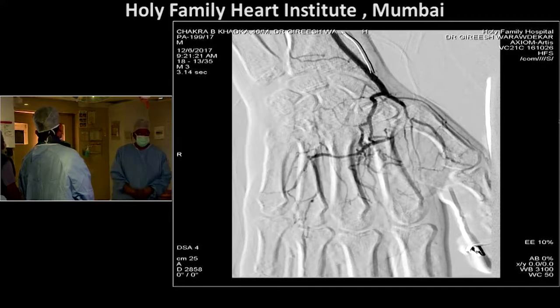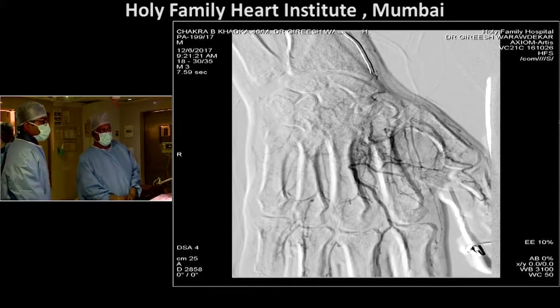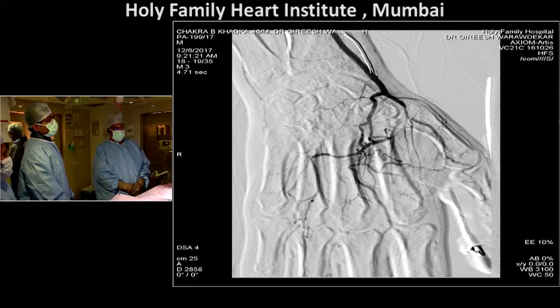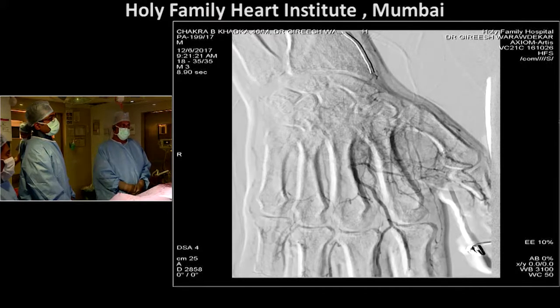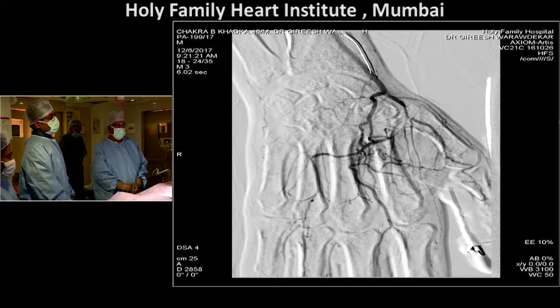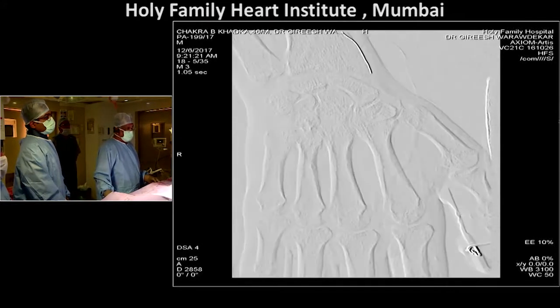Yeah, but the thing is that it's so small an artery. The smallest filter we have is 4 millimeters, so I don't think it's usable beyond a 3 millimeter artery. Right. If it was a fresh lesion, I would have said yes, I'd use a filter. But otherwise I would be a little apprehensive about using it because of the size, basically.